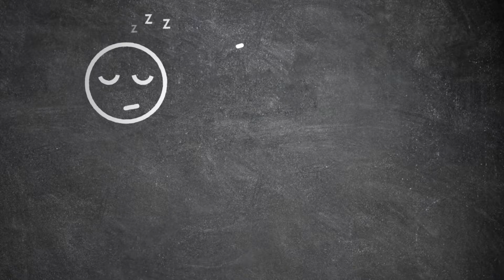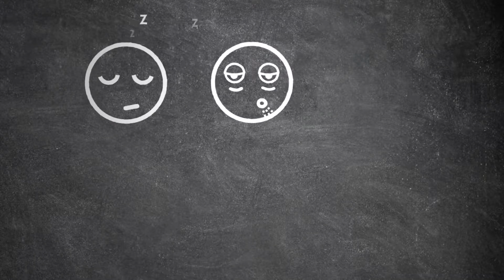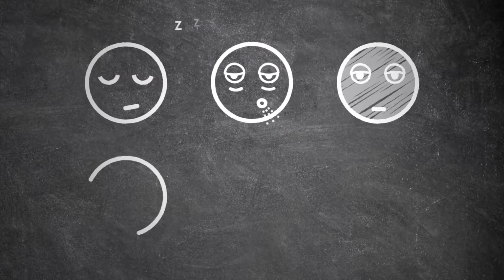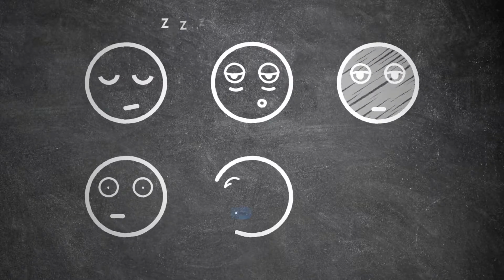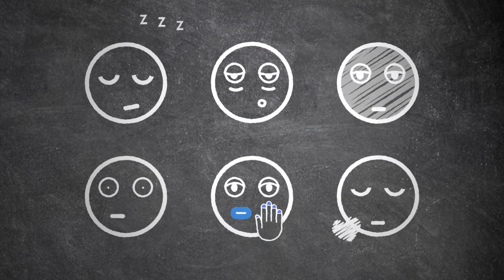They include a person who is unresponsive or overly sleepy, abnormal breathing, including breathing that is slow, erratic, gurgling, or no breathing at all, a face that is clammy or colorless, pinpoint pupils, blue lips or fingertips, or a pulse that is slow or has stopped.